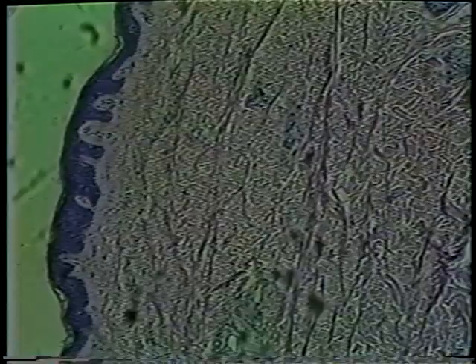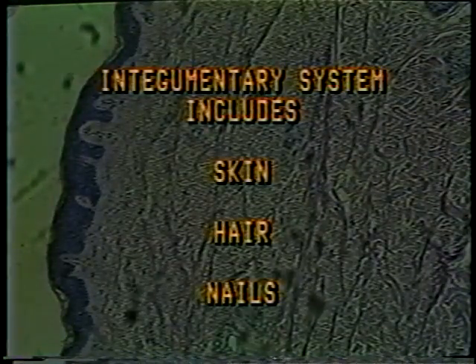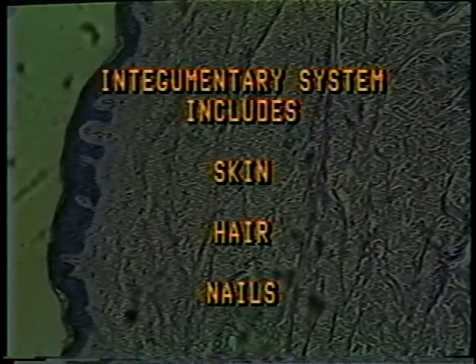The skin is often referred to as the integument because its general function is to provide a covering for the body. Thus, the tissues of the skin, its organs and appendages such as hair and nails, constitute the integumentary system. This videotape will show you the major microscopic structures of the skin and its appendages and discuss briefly the function of each.